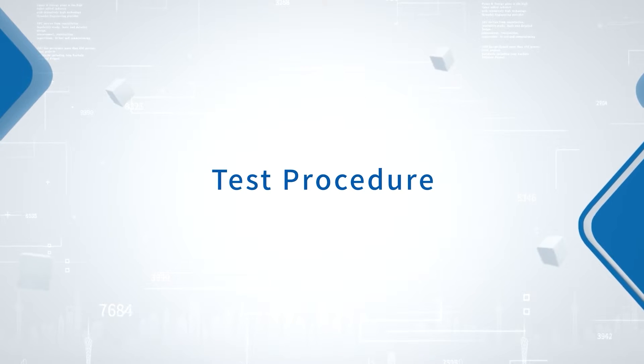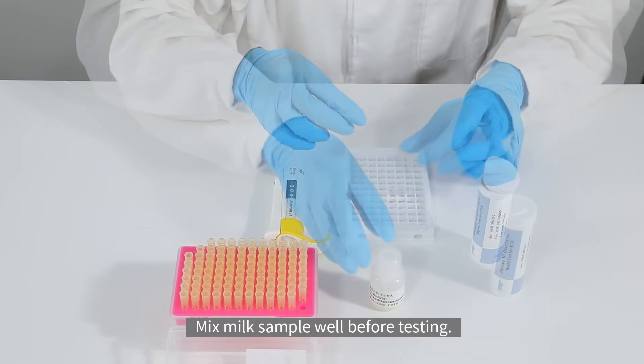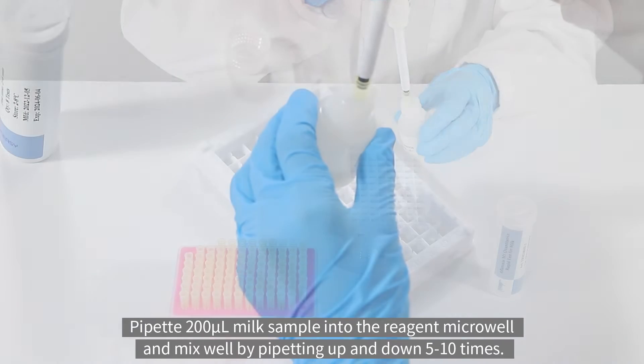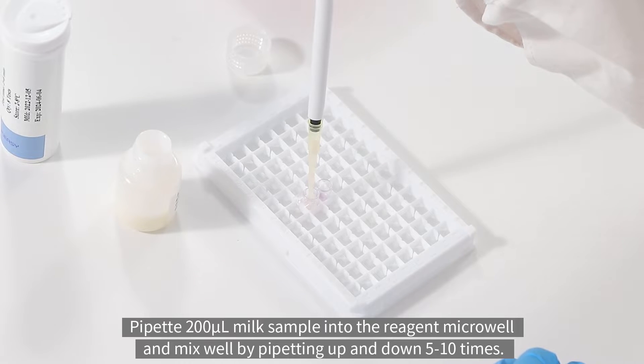Test procedure: take the required number of micro wells from the test tube and mix the milk sample well before testing. Pipette 200 microliters of milk sample into the reagent micro well and mix well by pipetting up and down five to ten times.